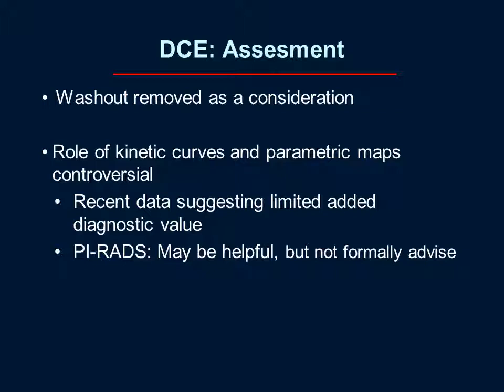And in this regard, the kinetic curves and parametric mapping have really become controversial, with recent data suggesting that there is limited added diagnostic value compared with simply looking for the focal early enhancement. PI-RADS indicates that some of these more complex approaches to evaluating DCE may be helpful, but are not formally advised.